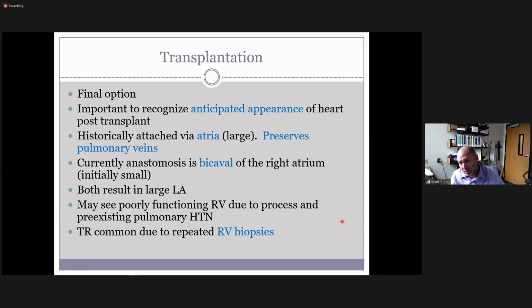You've got to prove that the distal end of it is open as well. So you need to see flow through it, and you need to see the anastomoses where they're attached, right? And then sometimes you might show the native area, but that's kind of irrelevant at that point, to be honest. And then we look at the flow before it and after it to make sure that that wasn't compromised.